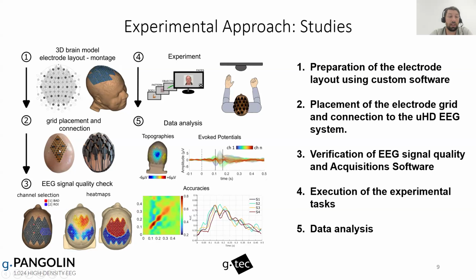And with that, we keep the inter-electrode distance, as you see, and it also fits then in our brain model. So we got the MRI of each of our participants, and with that we can do source reconstruction and also do this placement of electrode grids in the software. So if we then prepared all the setup, the layout, the montage for our measurement, we attach the preamplifiers, we plug in the biosignal amplifier, and we can start up the software.